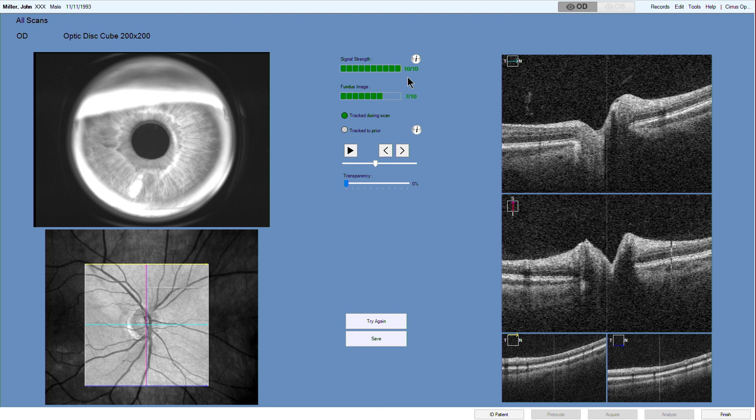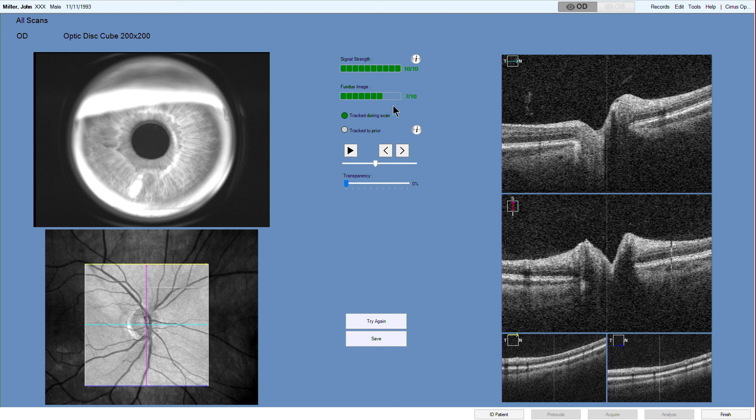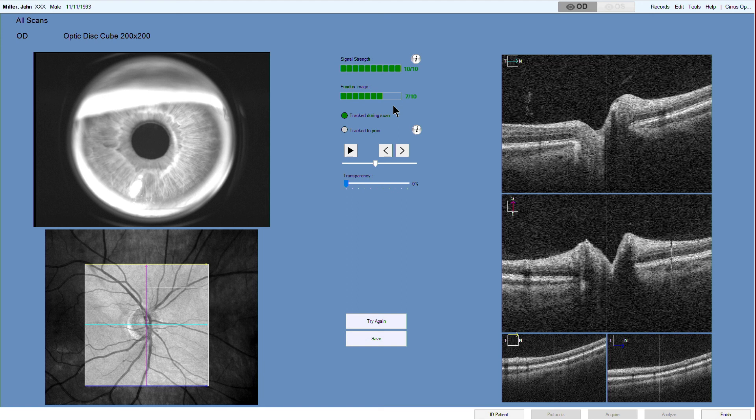To assist in scan review, the scan signal strength and the fundus image quality score is displayed on a scale of 0 to 10, with 10 being maximum. Signal strength values less than 6 are generally unacceptable. A fundus image quality score of 6 or above confirms that the quality is satisfactory to be used for a future scan.